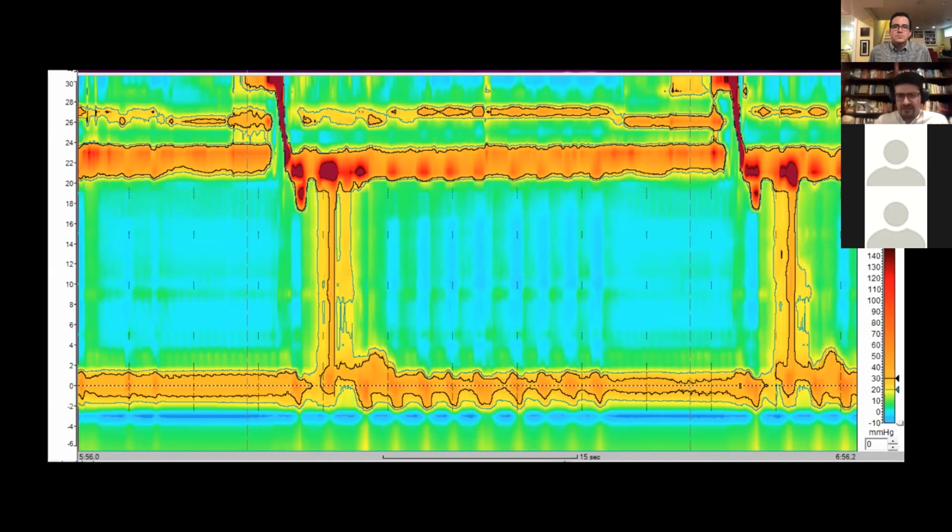Other than that, I think if you have subnormal peristalsis mixed in with any one of the features of, I'm sorry, of achalasia, sure, go look at that chart and make sure that this is not a case of pseudo-achalasia. I cannot remember seeing a pseudo-achalasia patient with type 1 achalasia. So my guess is that you'd probably see some features of spastic esophagus, panesophageal pressurizations.